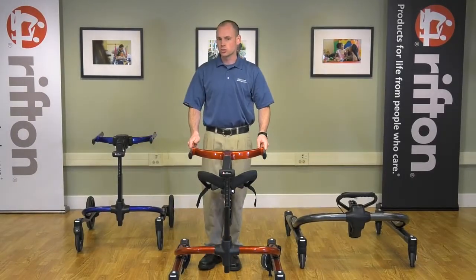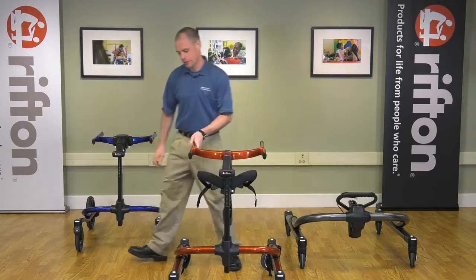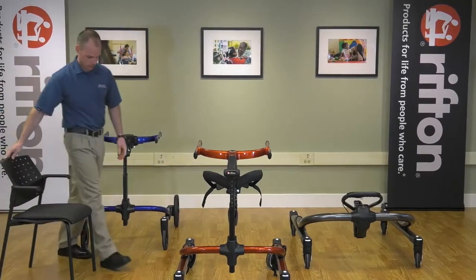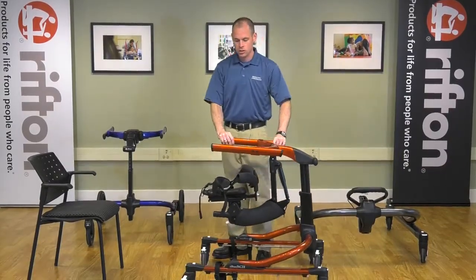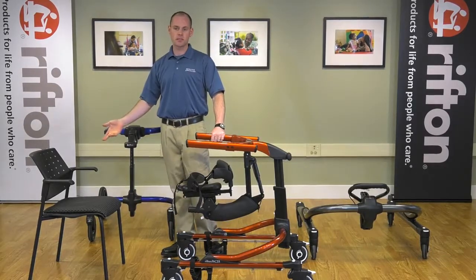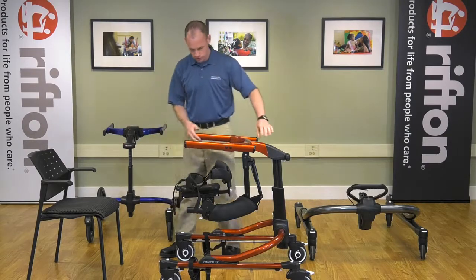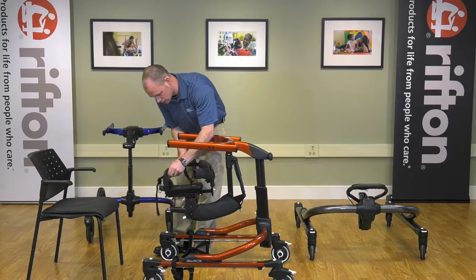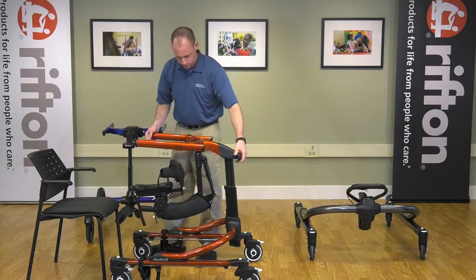I will now go on to loading and unloading of clients and demonstrate that using a chair here. So you turn your pacer, you'd have your client in some sort of seating device. It could be an activity chair or a wheelchair or something else. Undo the buckles here so the back pad hangs down behind, and then back up to the chair.